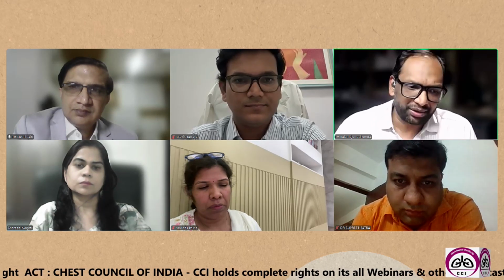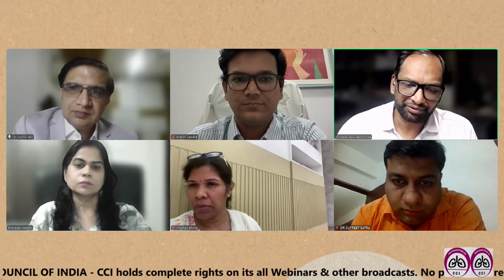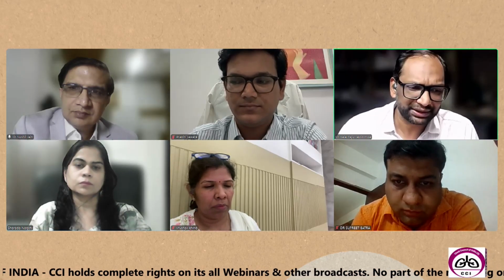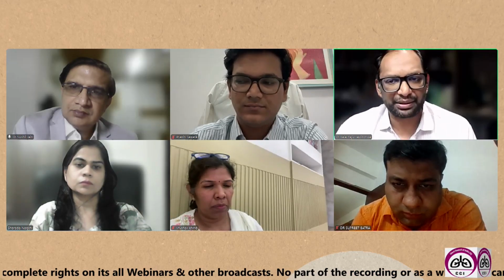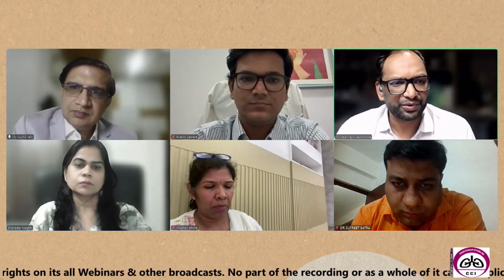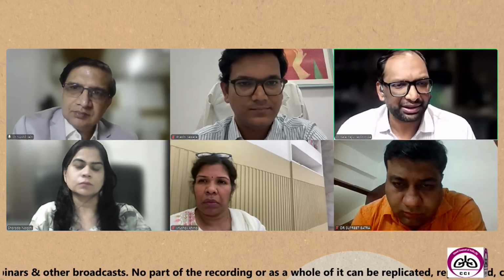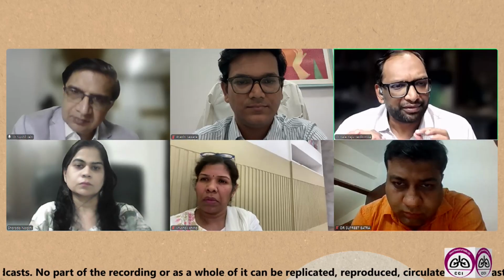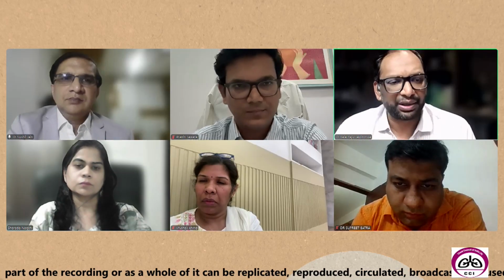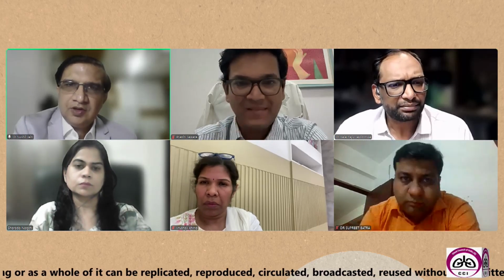And coming to the diagnostic part, in your talk and in others' talks, you already mentioned that more than 3 to 4 passes per lymph node, and you have to select at least 2 stations when you're doing a diagnosis. And most of the time, believe me, you don't have to bother about less than 10 mm lymph nodes because you will have more lymph nodes to sample, whether it is 4 or 7 or wherever it is. So I feel this is especially important for a staging EBUS. So less than 10 mm, positive or negative, I think we should sample the lymph node station at least. That's what I feel. Okay, thank you.